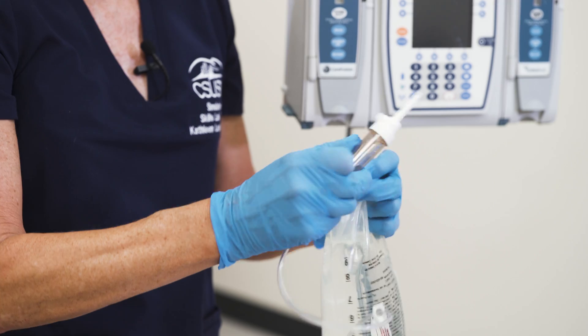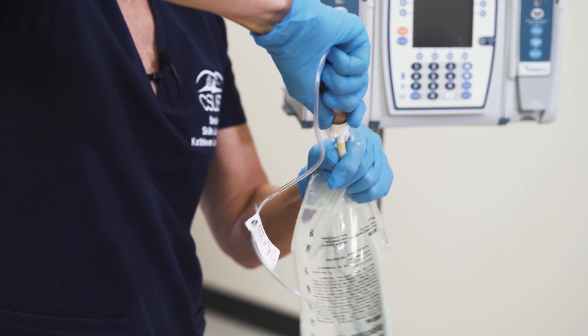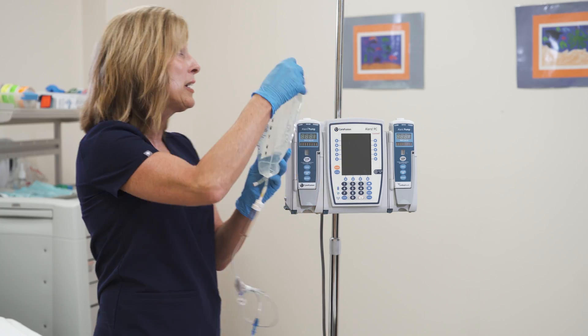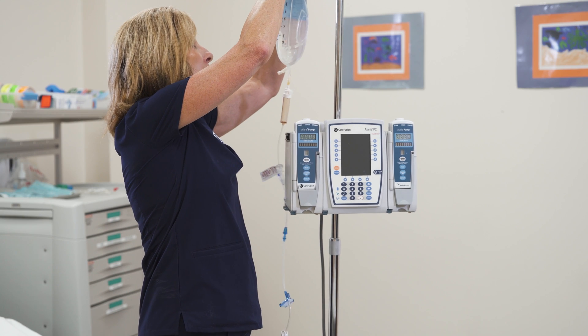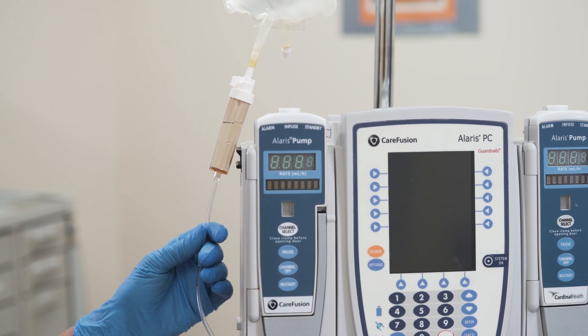Careful to keep this all sterile, we're going to go ahead and insert this spike into the bag with a twisting motion. Once we've done that we can hang it up on the hook and squeeze the drip chamber until it's halfway full.